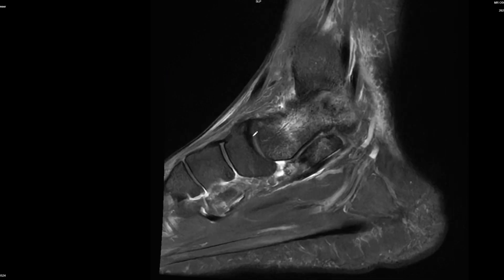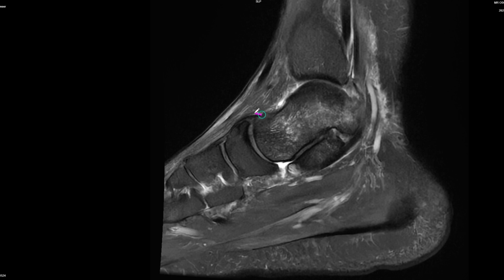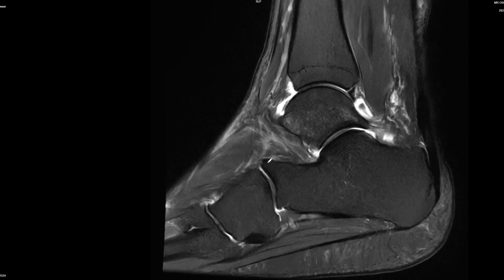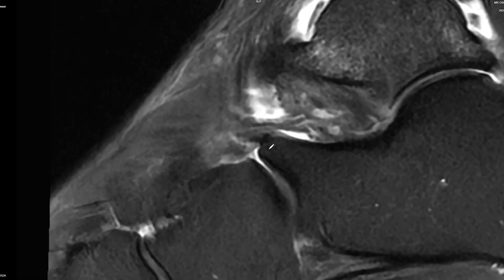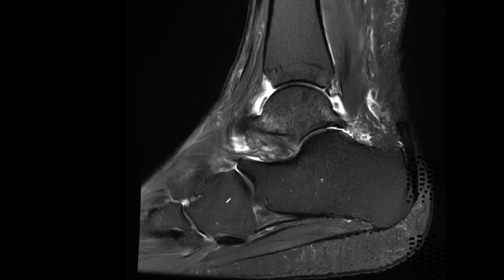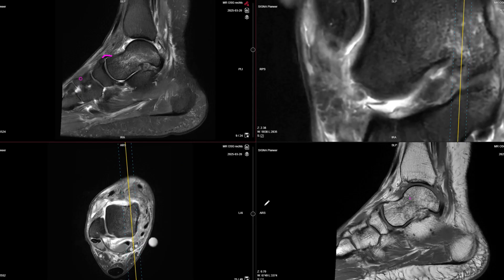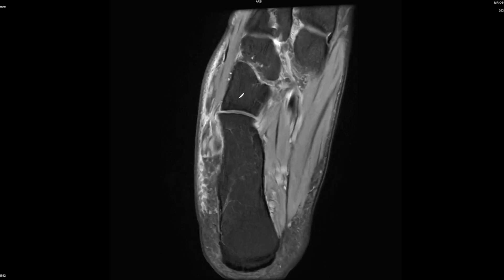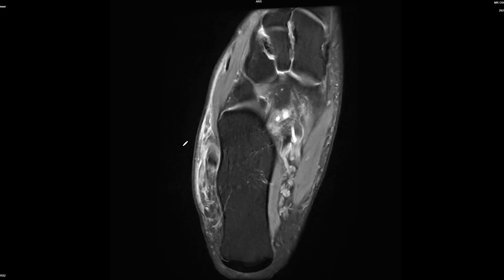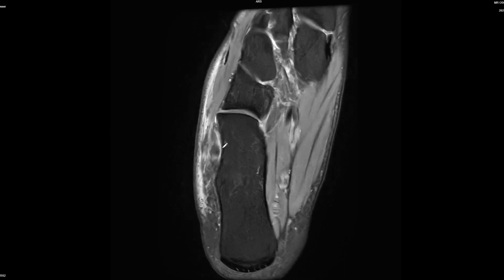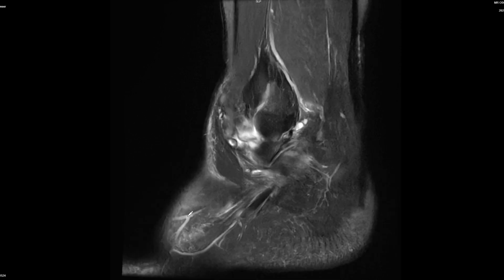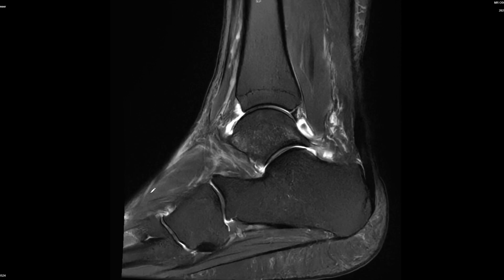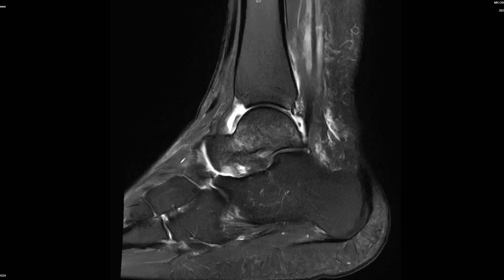Going to the smaller joints: the talonavicular joint capsule looks nice. At the calcaneocuboid joint we don't see much wrong - we don't have a perfectly outlined bifurcate ligament but given the normal joint capsule and normal tendon and joint capsule with no effusion, there's not a major injury here at the calcaneocuboid joint. The Lisfranc joints are also intact.